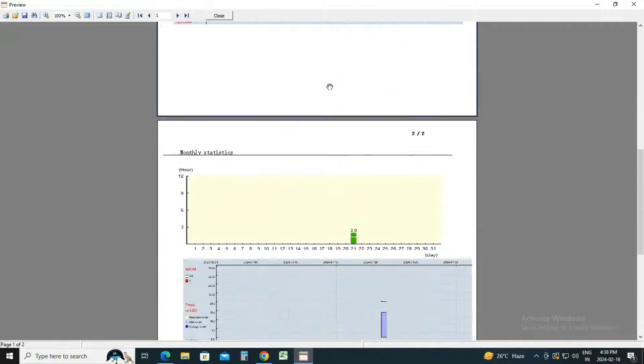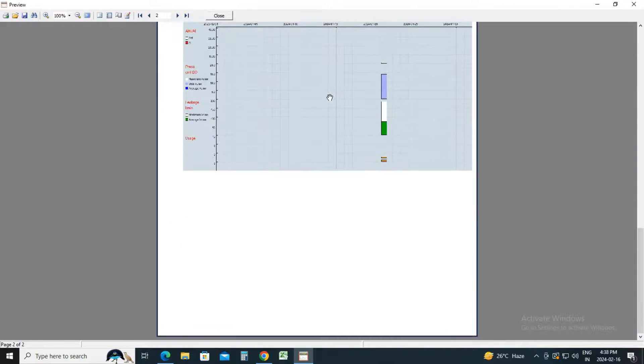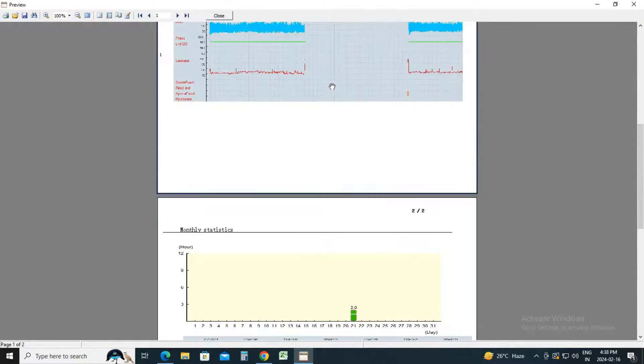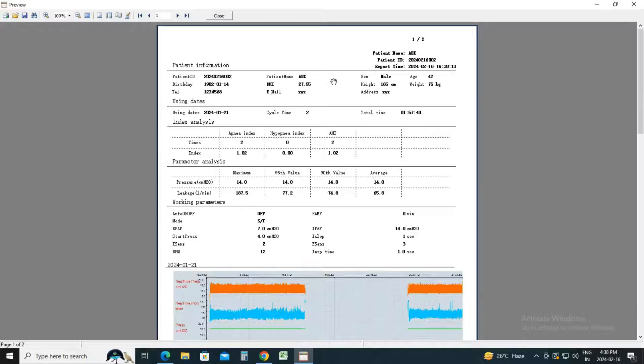By following these steps, you'll be able to successfully download and analyze the report for your Evox CPAP and BiPAP devices.